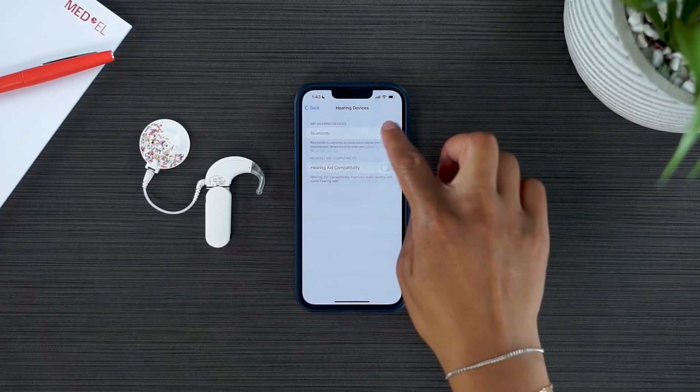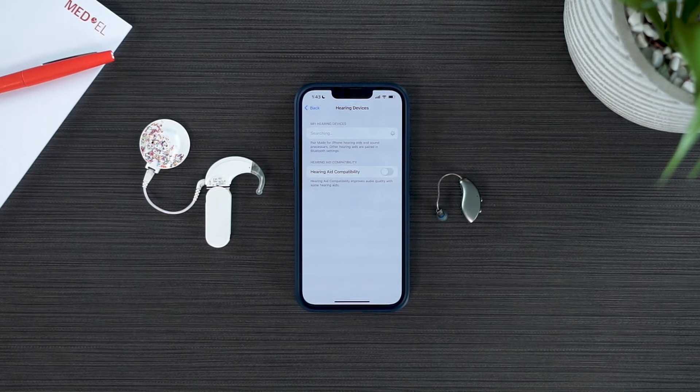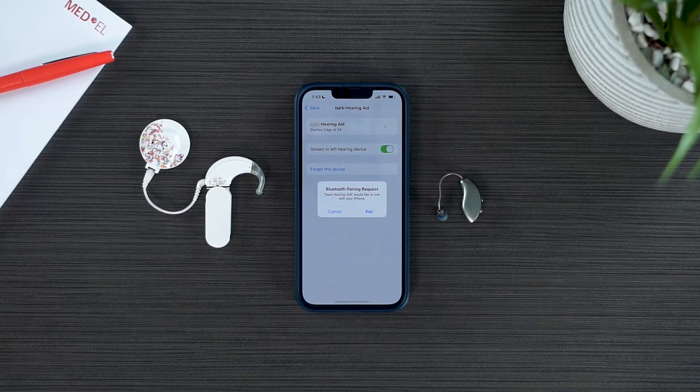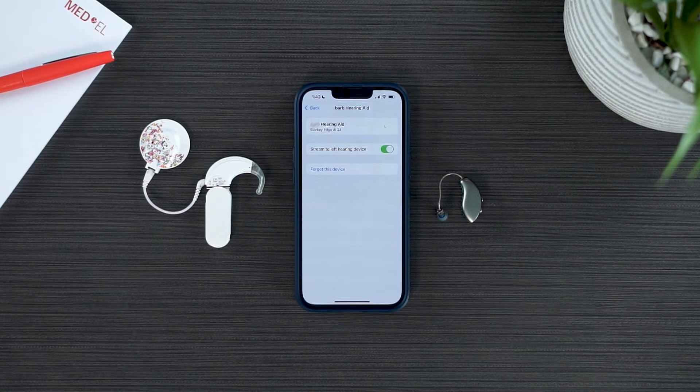Turn on Bluetooth and then power on your Starkey hearing aid. Select the hearing aid when it appears on the screen, and finally select Pair. You have now successfully paired your Starkey hearing aid to your mobile device.